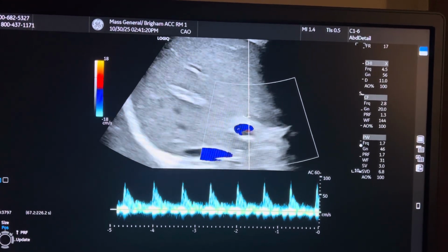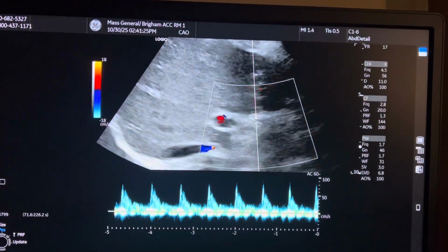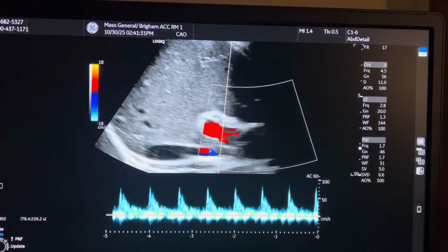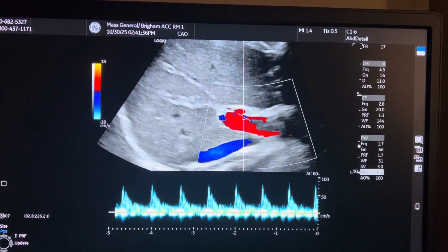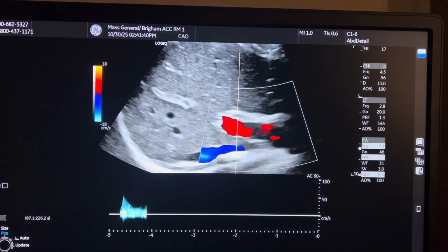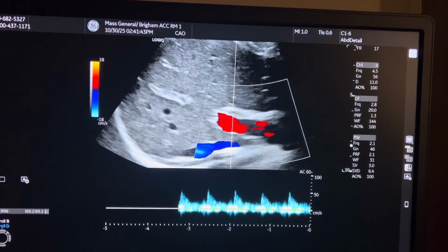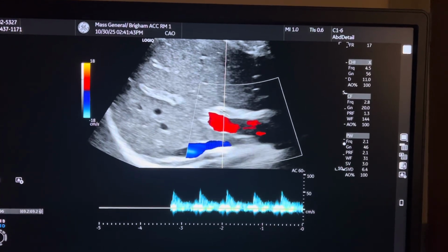Breath and hold. Breathe for a sec. Tiny breath and hold it. So this one's worse. Breathe. So I like my original one better. This is why we don't just take one sample and say, ooh, we got it. Like you have to keep trying and make sure that your reading is accurate.